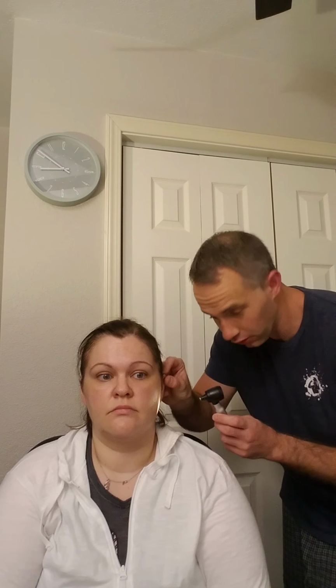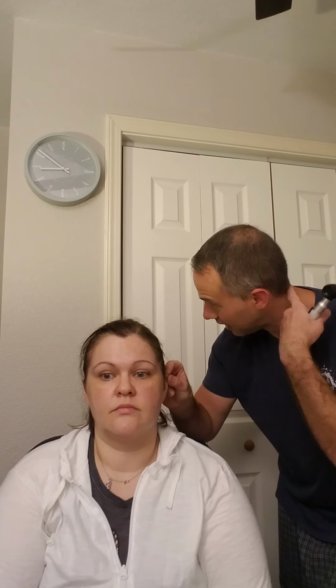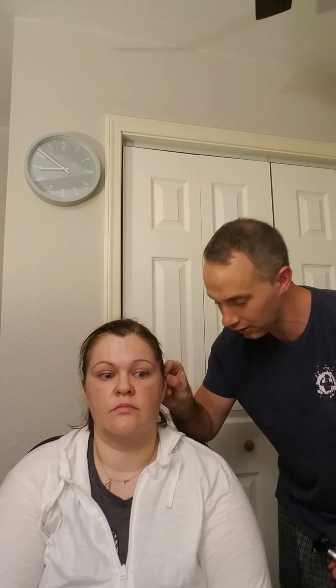I'll then look inside the ear. For an adult, you're going to pull the pinna up and back to straighten out the canal. And I will visualize inside the ear. What I'm looking for is any redness, swelling, any sort of, some earwax will be normal, but any amount of earwax that would occlude the patient's hearing that may be causing pain or, again, loss of hearing.